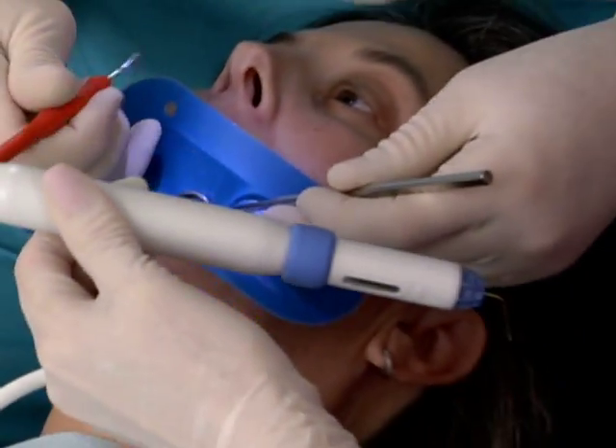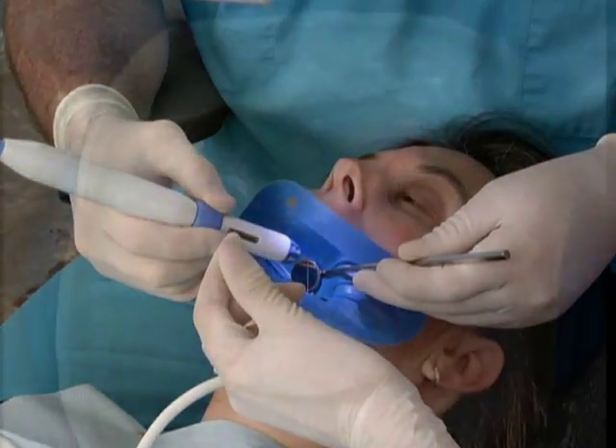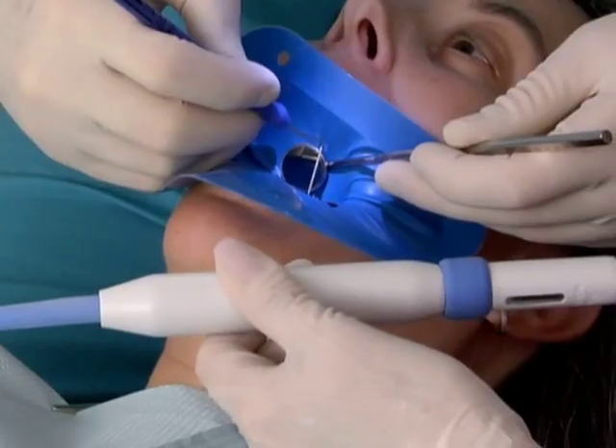But because every situation is different, you may find that tooth location and the individual patient's ability to open call for different grip techniques with the Calamus Flow.